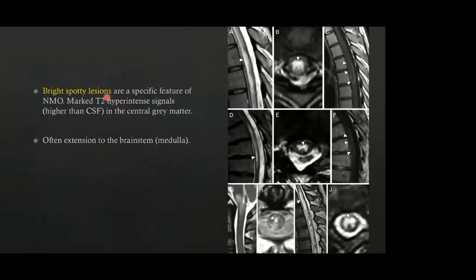Bright spotty lesions are a specific feature of NMO when observed. These are markedly hyperintense T2 signals higher than adjacent CSF, located in the center of the gray matter. On these images, the characteristic H-shaped appearance of the gray matter is diffusely hyperintense on T2, giving rise to the bright spotty lesions. There is diffuse involvement of more than two-thirds of the transverse diameter of the cord, and lesions often span to involve the medullary junction and brainstem.